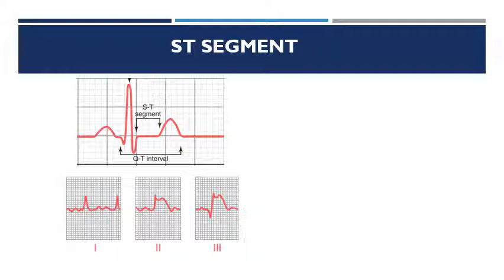Next is ST segment. ST segment is the segment from the end of S wave to the start of T wave. It is a segment from end of S wave to the start of T wave.